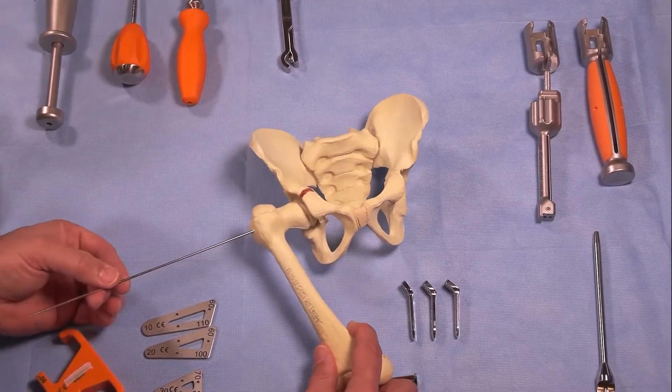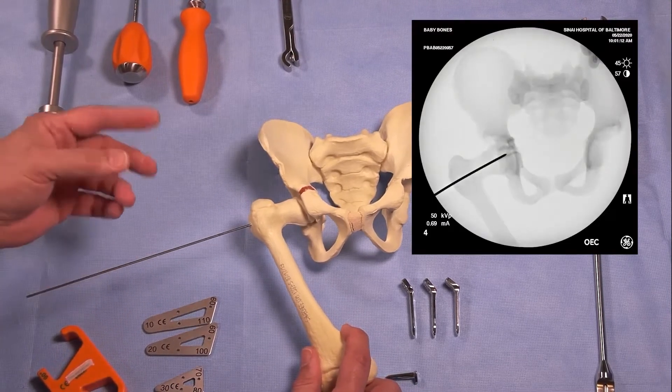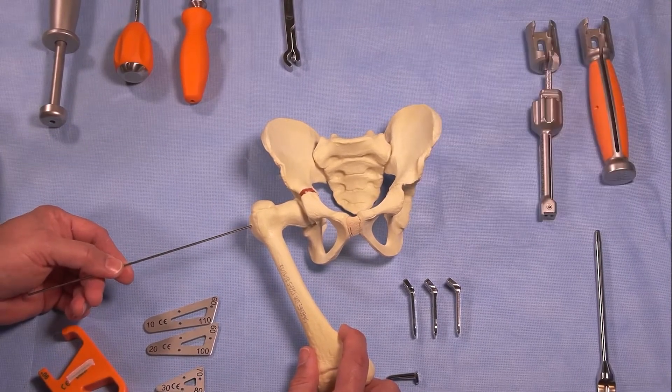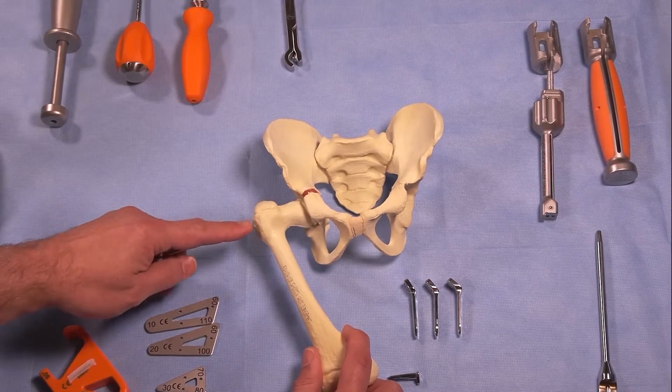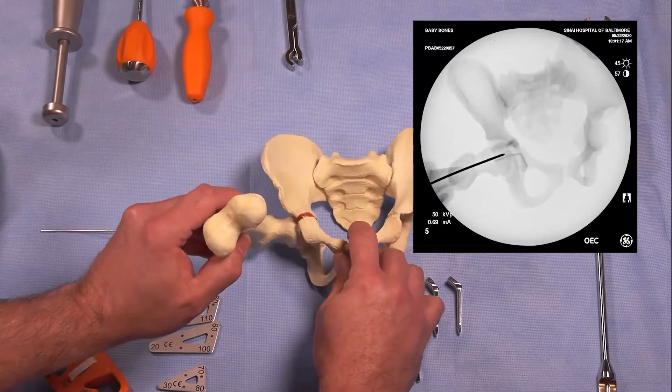The first part is the insertion of the guide wire. I've already done this under fluoroscopy. As you can see in the image on the screen, we've placed the guide wire in a 1-1 position up the femoral neck in both the AP and the sagittal position.